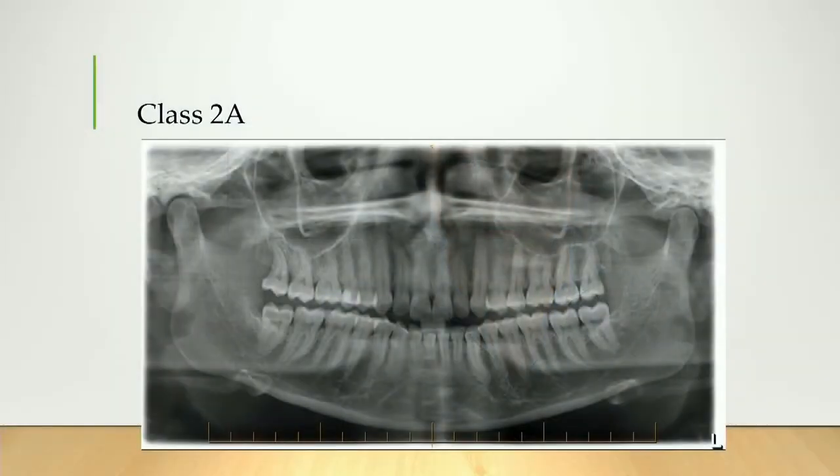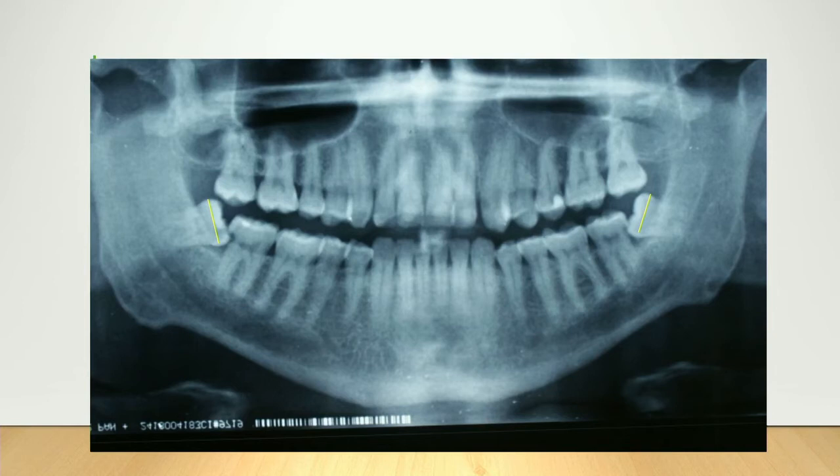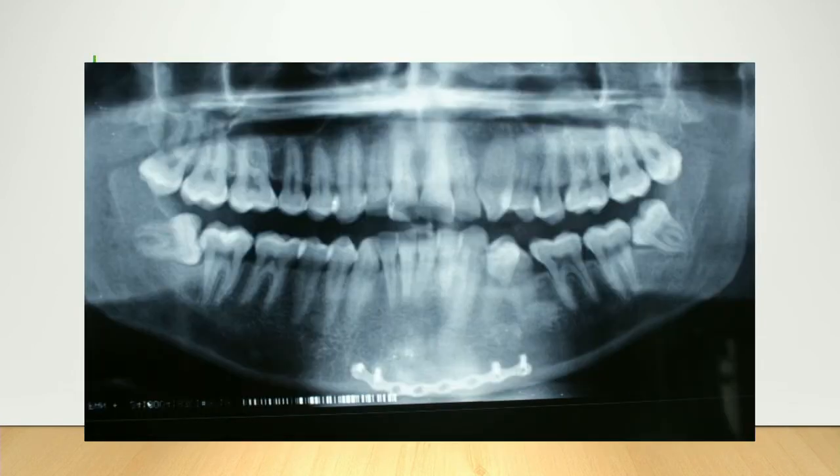If there is not much tooth structure left. So I don't know if I have a specific x-ray for you. Let's see if we can find one for you. Yeah, let's have a look at this one. For example, let's pretend that this tooth had caries. So there was, say, not much of the tooth left. Okay, if you're lucky, you'll still have some mesial.